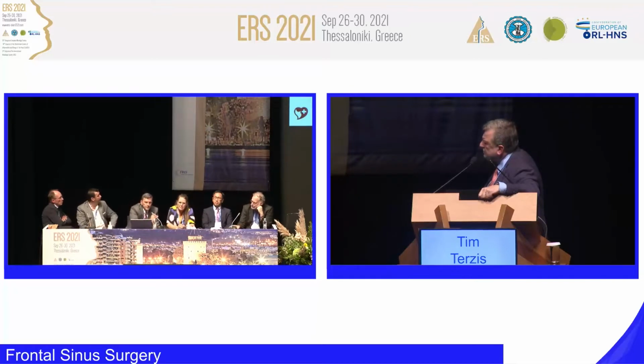I think in this case we need an incremental approach, and the decision will be made intraoperatively. So I will start to drain the frontal sinus, because this is a classical post-traumatic chronic frontal sinusitis, because you see also neo-osteogenesis, you see that the bone is also active, and this is something that shows us that this is a long-term infection there. Yes, and of course he had the symptoms for at least 6 months.